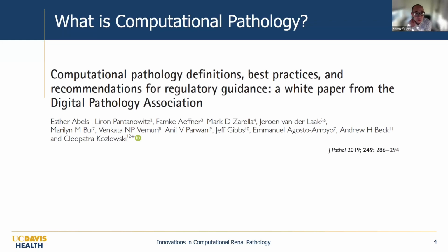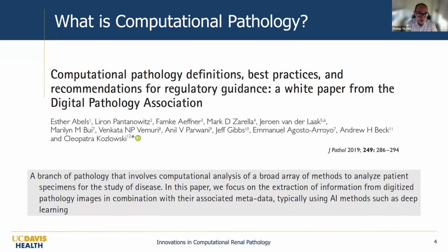All right, so what is computational pathology? Well, this paper from a few years back from the Digital Pathology Association has some definitions, and I quote this paper saying that computational pathology is a branch of pathology that involves computational analysis of a broad array of methods to analyze patient specimens for the study of disease.